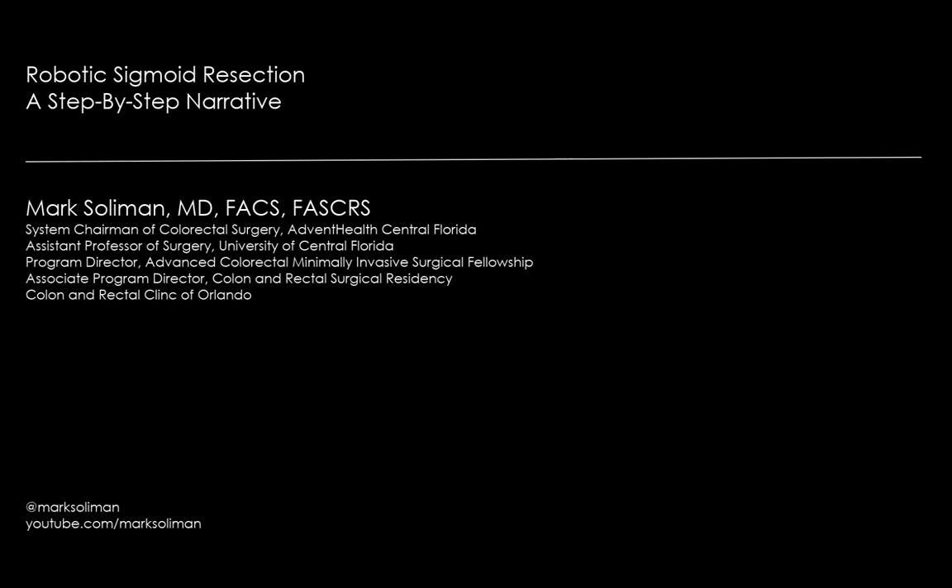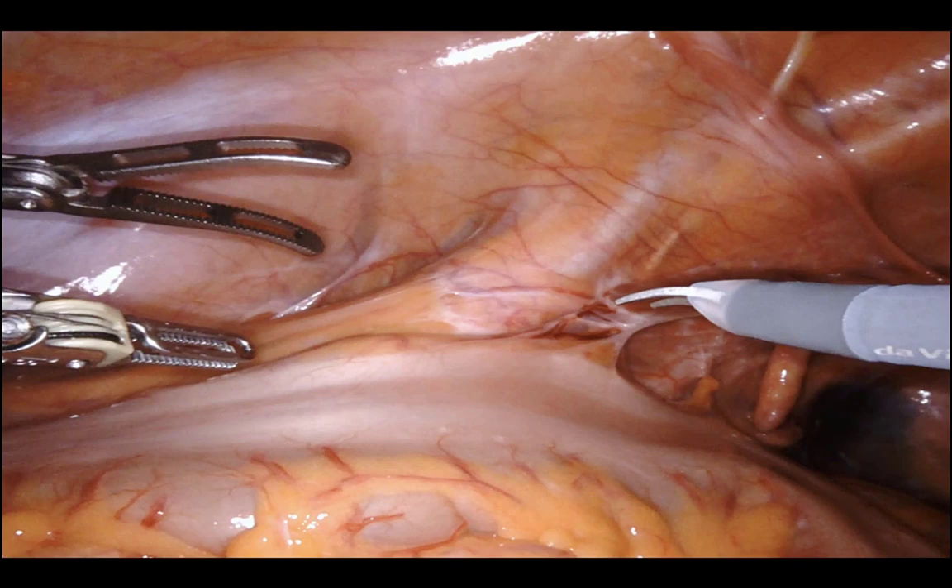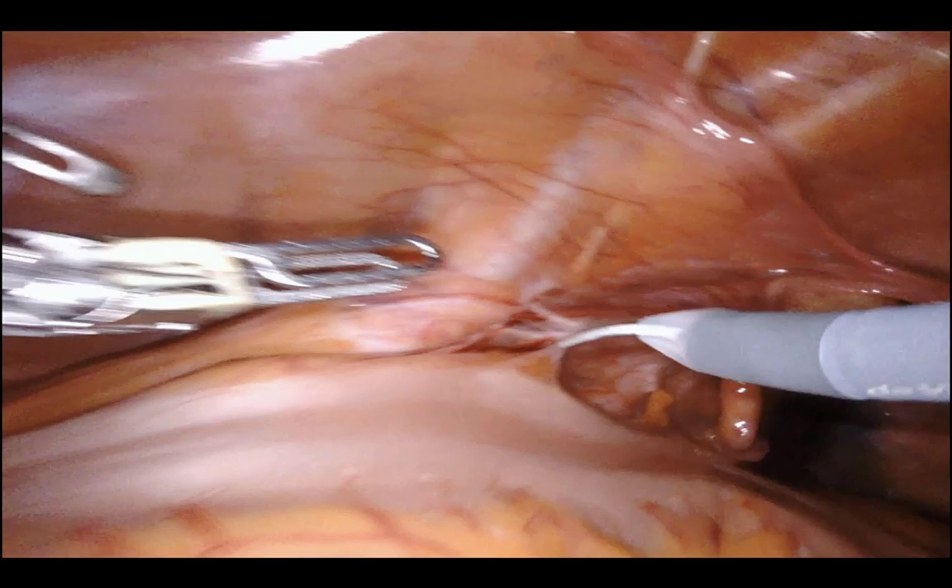A little case context: this is a middle-aged Caucasian female with a recto-sigmoid adenocarcinoma that has a tattoo in it and some filmy lateral adhesions. I want to walk you through the choreography of this operation from start to finish. It's about an hour, but I'll speed through the setup and more mundane parts.